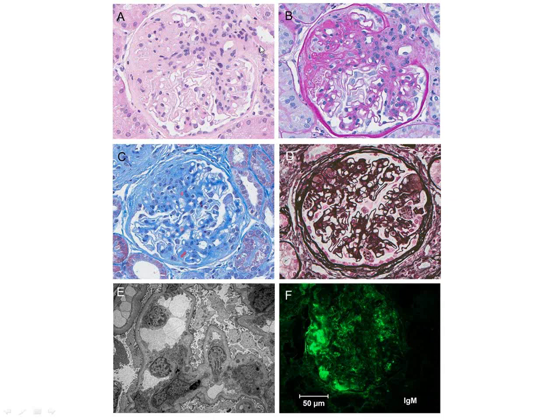It can happen with a lot of different types of glomerular injury, so it does not implicate anything about pathogenesis. That was an aside, my little comment about pathogenesis. That would not go into my boards description. But there is mild mesangial hypercellularity. I think you guys can see that on A and on B.